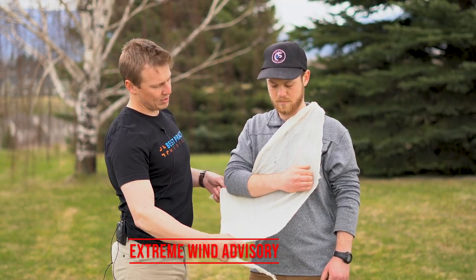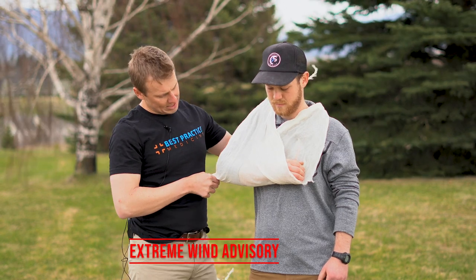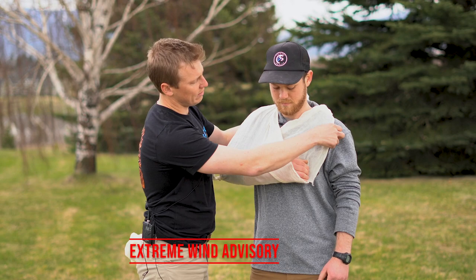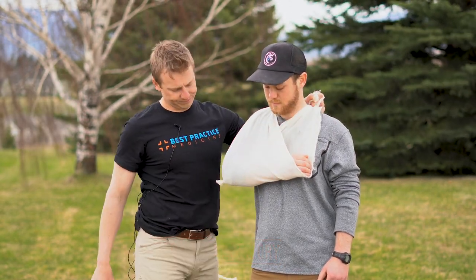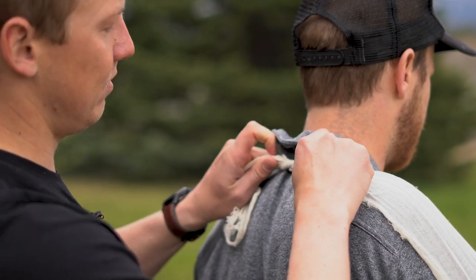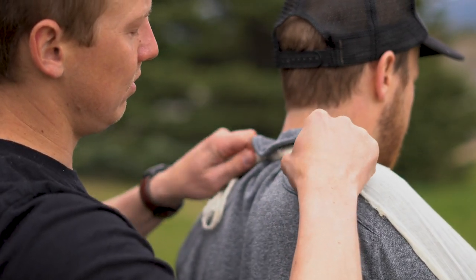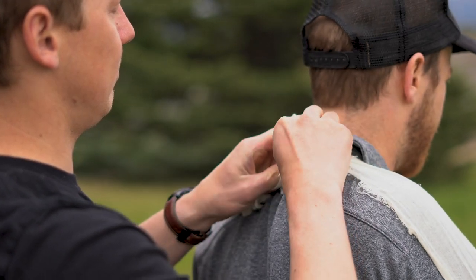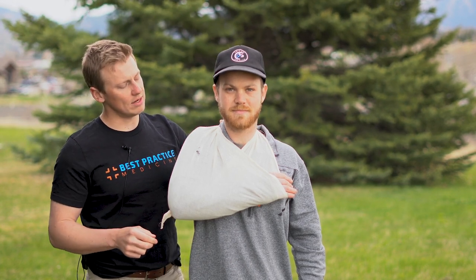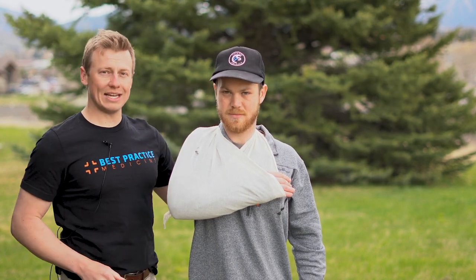This will form a suspension line and help adequately support the extremity. The side further away from the patient's body is then wrapped up over the opposite shoulder, minding the pocket and effective even tensioning of the splinting material all the way across. Once the splinting material is properly positioned, prepare to tie a knot around the patient's back. Before you finish your knot, pull up on the splinting material in order to effectively take the weight off the extremity. You don't want to displace the shoulder so much that it causes unnecessary pain, but pulling a little extra tension will account for slippage in the knot and stretching and sagging of the material.